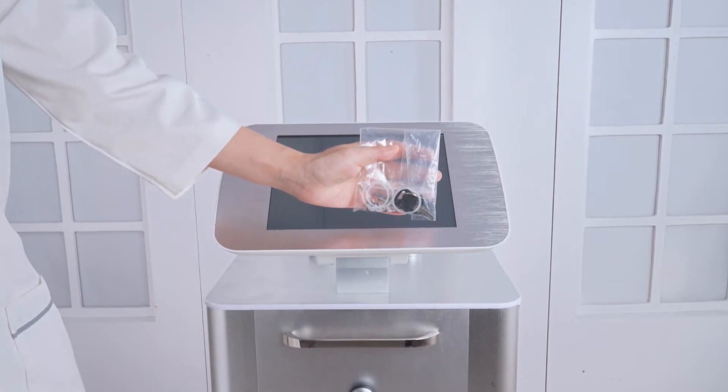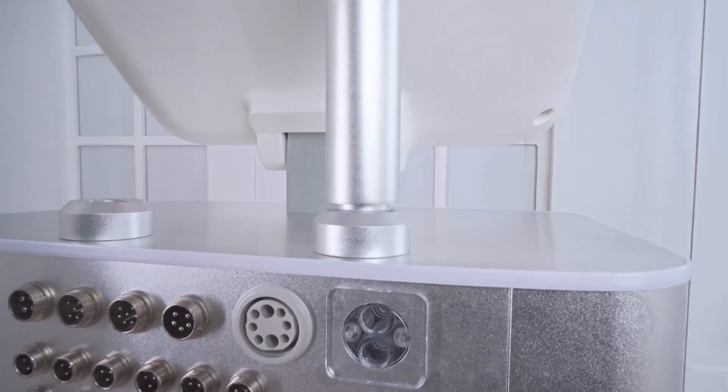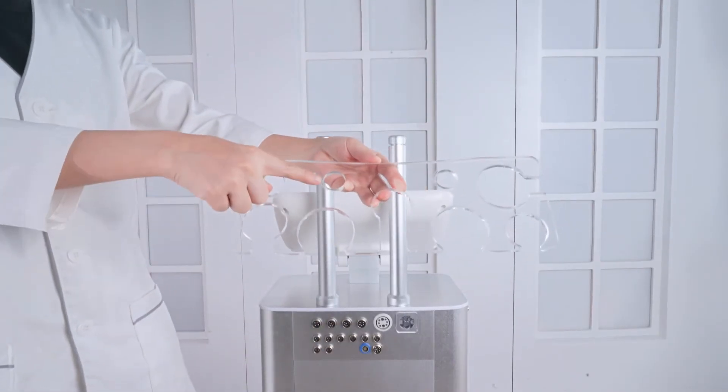Take out the device and all accessories. Take out the two cylinders, unscrew the cover at one end, install the cylinder on the device, then install the rack on the cylinders. Screw to fix the accessory rack.